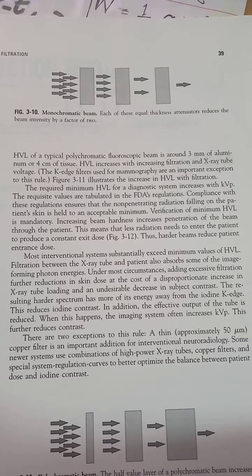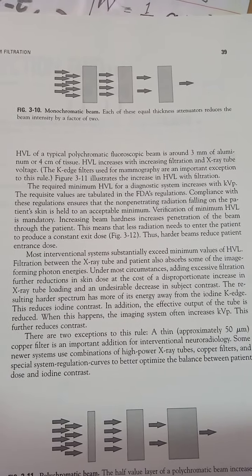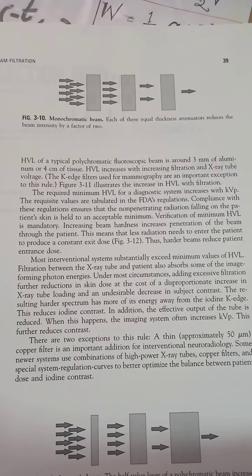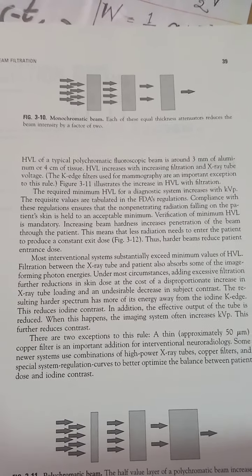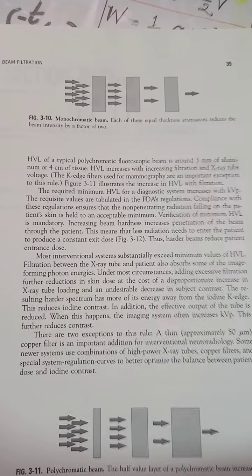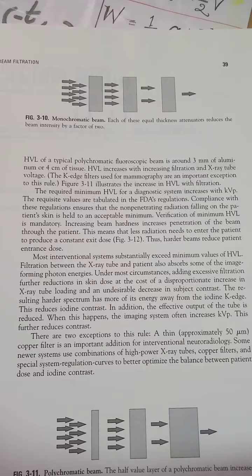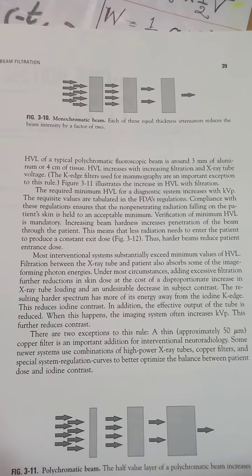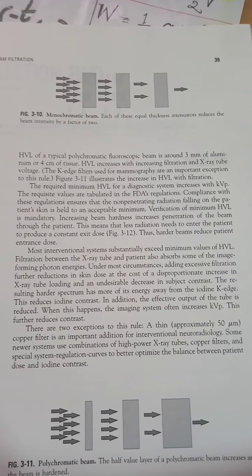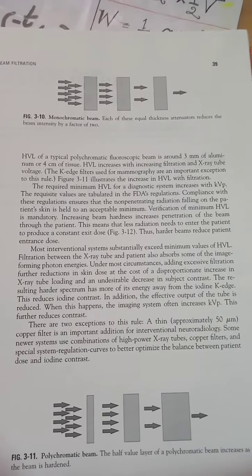into the patient for producing a constant exit dose. Thus, harder beams reduce patient entrance dose. So harder beams do the work with a lesser amount of exposure. Most interventional systems substantially exceed minimum values of HVL.